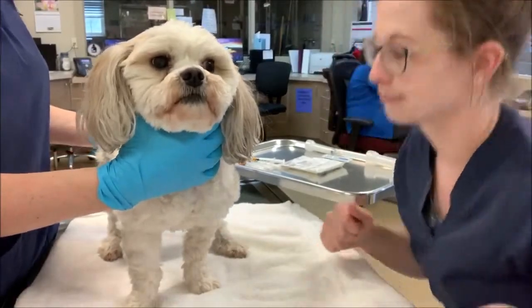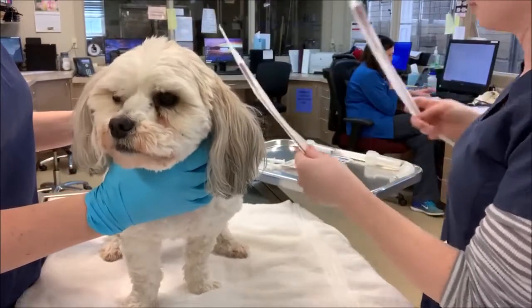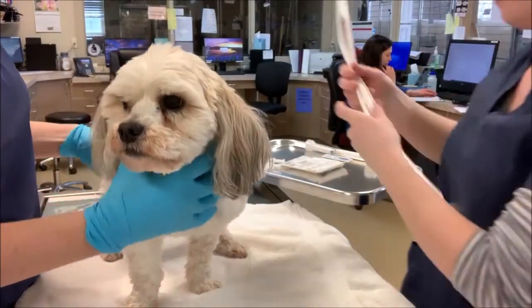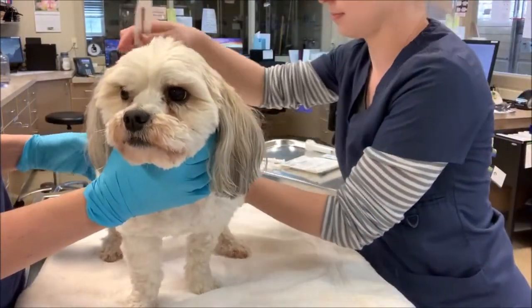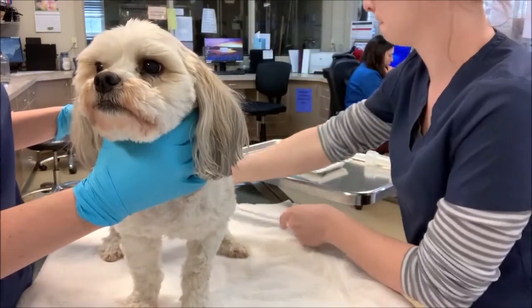Hello, today we're gonna be placing a urinary catheter in this male dog. First I'm choosing the size of my catheter that I'm going to be using, measuring from the tip of the prepuce to the rim of his pelvis.